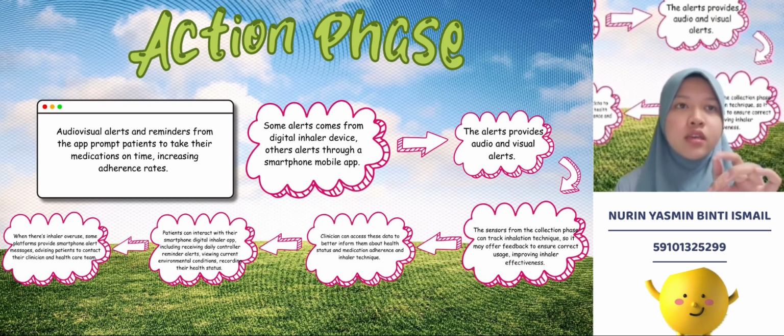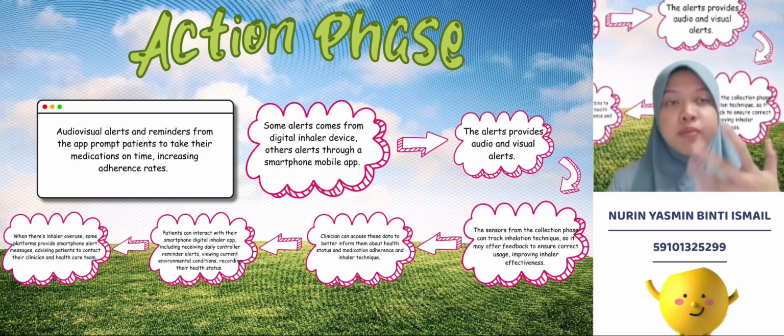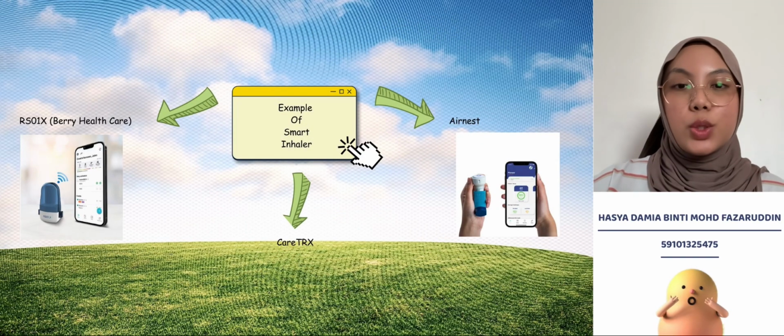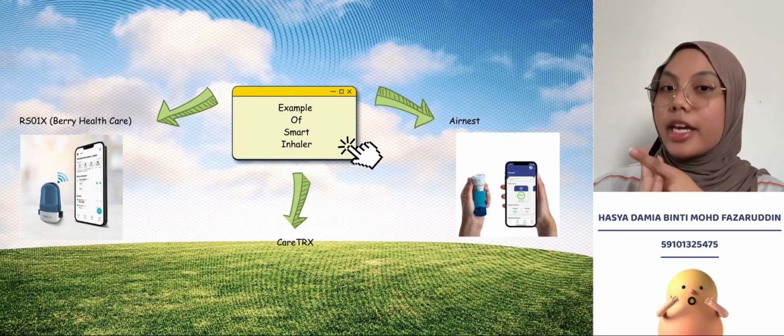Lastly, if there is inhaler overuse, some platforms will provide a smartphone alert message advising the patient to contact their clinician and healthcare team, so the patient will not panic after overusing the inhaler. These are a few examples of healthcare awareness and care.